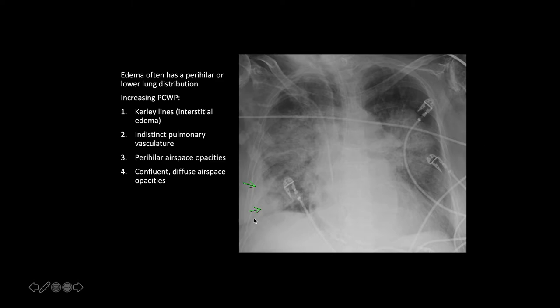Here's a more severe example of pulmonary edema; the arrows are pointing to a pleural effusion. Other clues that a process is pulmonary edema compared to other diffuse interstitial or airspace processes: these patients often have cardiomegaly and pleural effusions, and the finding would also be acute if you have prior studies to compare with.